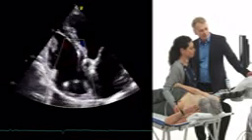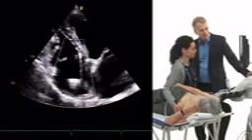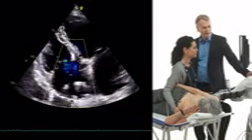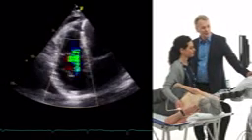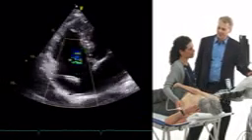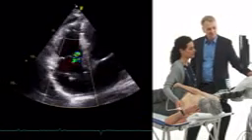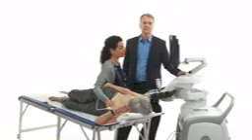very similar to the mitral valve. It looks like the jet sprays a little bit, but you focus on the proximal portions. Okay, maybe try to image from an intercostal space further up and down. Usually it's a good trick to get a wide. Yeah, here you see it. See, this is a very good trick. And looking at all these images, how severe do you think TR is? We can say it's at least moderate to severe. I would agree completely. Yes.